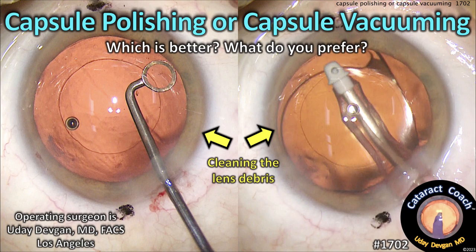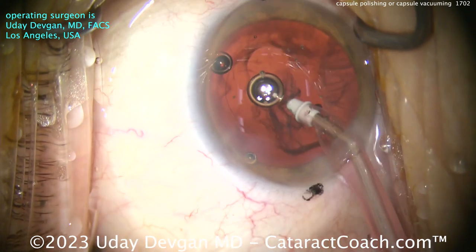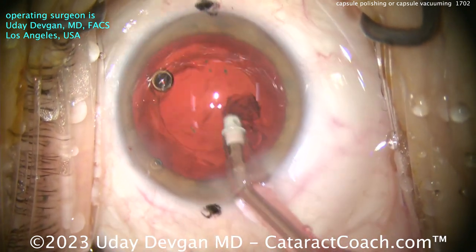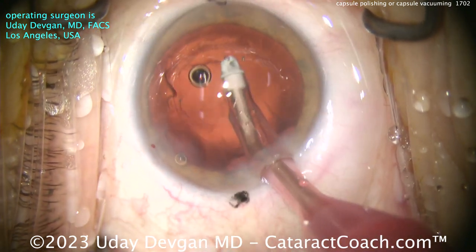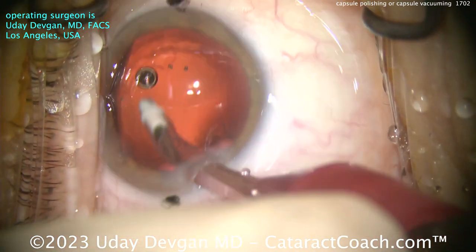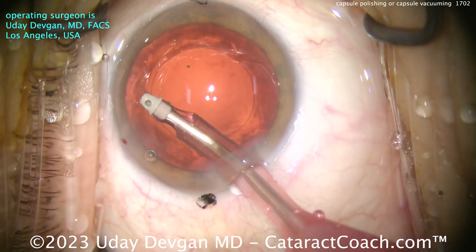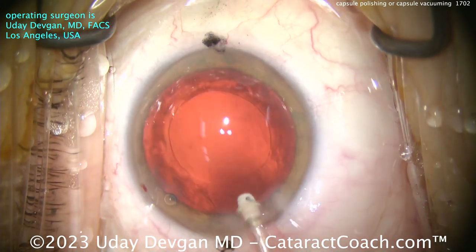cataractgoof.com — capsule polish or capsule vacuuming: what is better, what do you prefer? Let's look at this routine cataract case, nothing out of the ordinary. Nice rhexis, cleaning up the cortex, everything looks pretty good. Nice incision, good draping. But as we clean up the cortex, you can see on the undersurface of the anterior capsular rim there's that frosty stuff — those lens epithelial cells or some cellular debris.